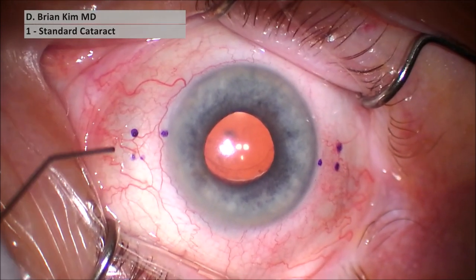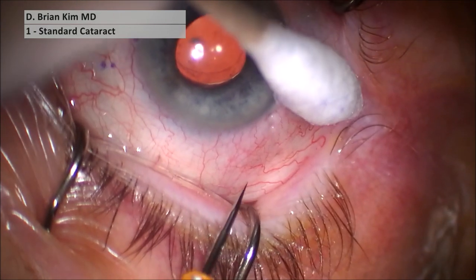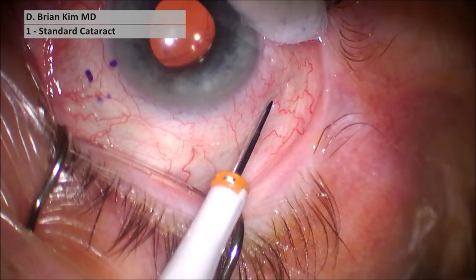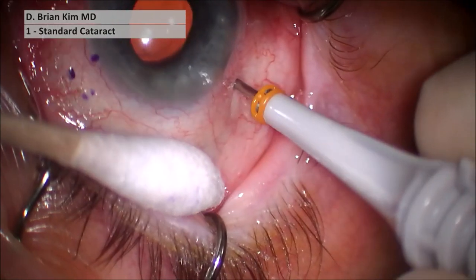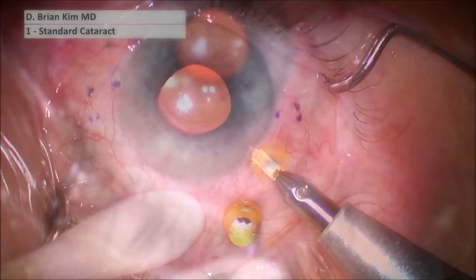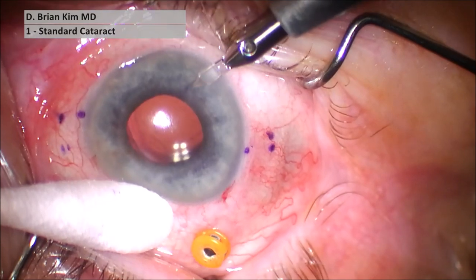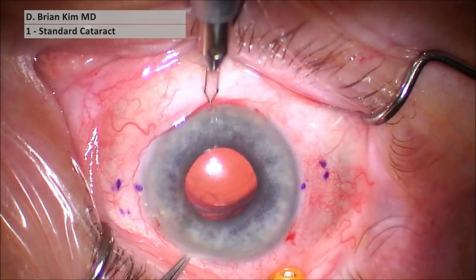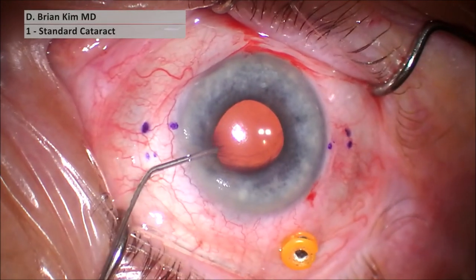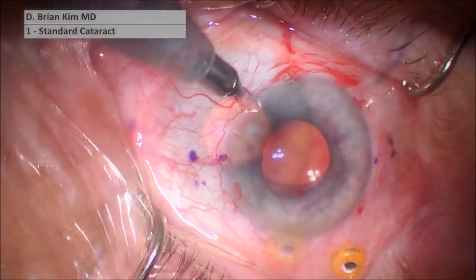Once I've made my marks, this is an indentation four millimeters posterior to the limbus using the trocar — this is a 23-gauge. I tunnel through the sclera, and as I tunnel, I rotate 90 degrees and then enter. When you come out and see the trocar slightly sideways, that means you have a really nice tunnel. I go ahead and make my incisions. The first two were for the explantation, the third for the AC maintainer, the fourth for the externalization of the leading haptic. All of these other incisions are for the iris hooks. When you have poor visualization, don't be afraid to use iris hooks.